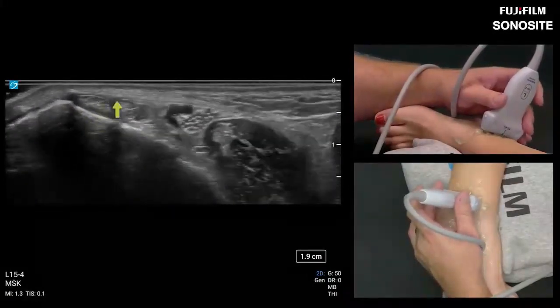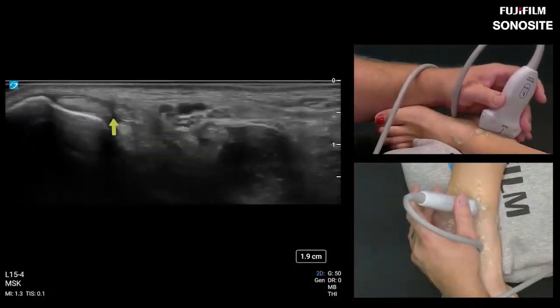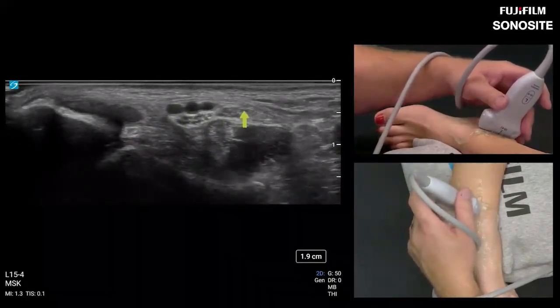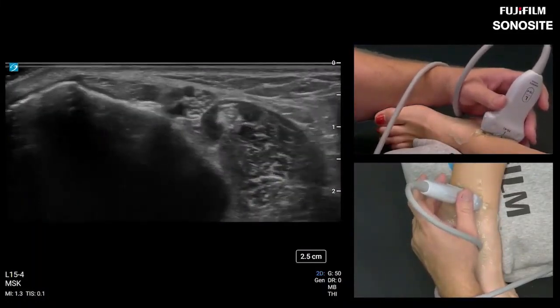It does have a neighbor here. This is the flexor digitorum longus. Okay, and then they border each other. They pretty much touch each other right there. And then a little bit further back in the image, we can see the neurovascular structures, which we'll focus on here momentarily. But then we see this large muscle mass headed towards the Achilles.